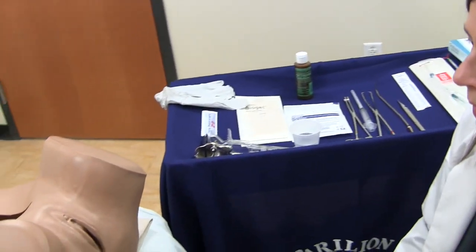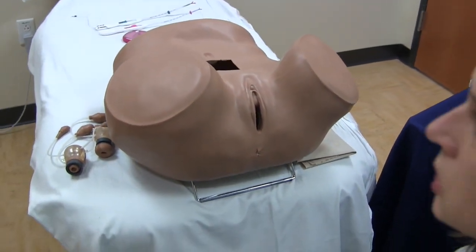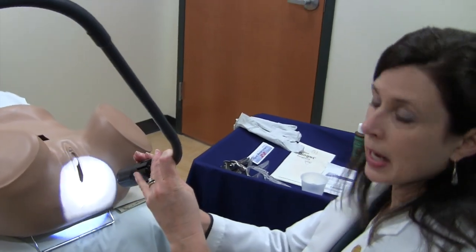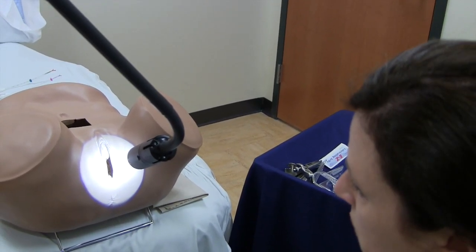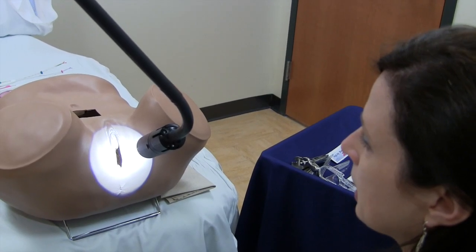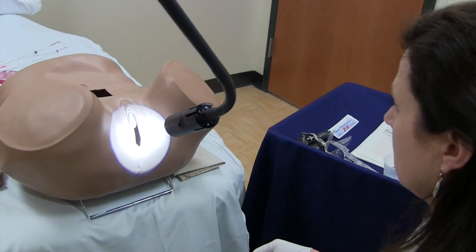There are many things that you can address as far as the formatting of this particular workshop. For the model itself, we will demonstrate briefly the quick insertion and visualization of the cervix, whether it is using a clinic floor light, a pen light, or even a flashlight if need be. It is quite easy to change out the cervix and the uterus models. Learners can practice their speculum insertions under faculty supervision, which is something you can give feedback on.